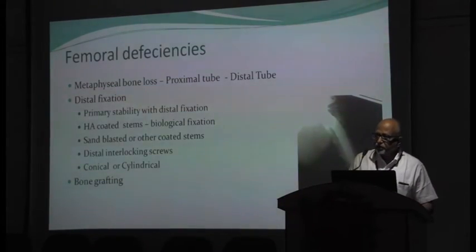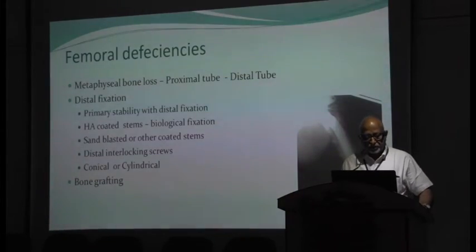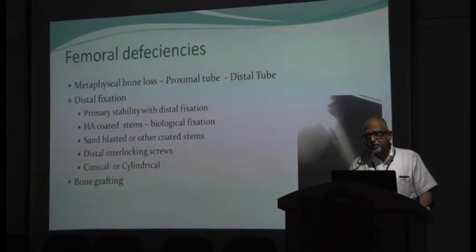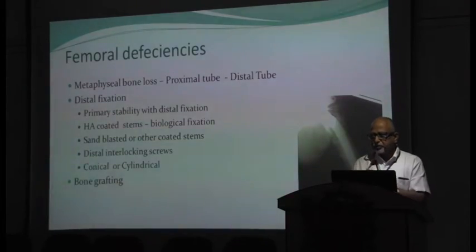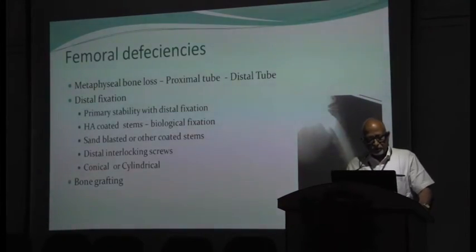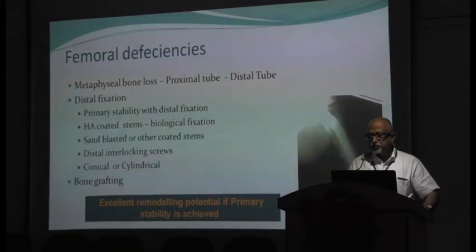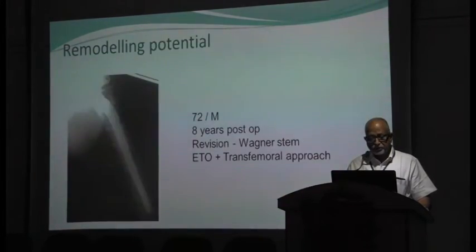With all the things that have already been talked about, one understands that the potential for remodeling of the femur is extremely good, especially if you have addressed primary stability and the biology of the situation you are dealing with. A number of prostheses are available, so you need to make a decision in advance as to what type of prosthesis you are going to use, and probably keep all options open when you are dealing with these kinds of things, including bone grafting. The remodeling facility of the proximal femur after you do a revision is very good.